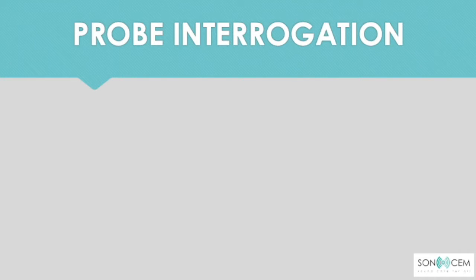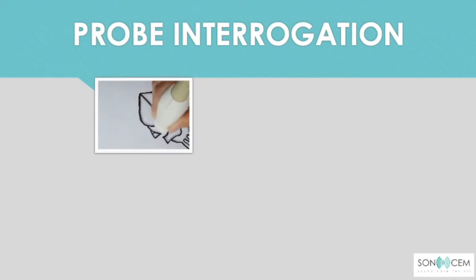So now let us learn the basic principle in doing ultrasound. We go through how we manipulate the probe so that we can get better images. First, sliding is the movement of the probe in any direction to a different part of the chest. Sliding is useful for tracing potential structures distally and proximally.